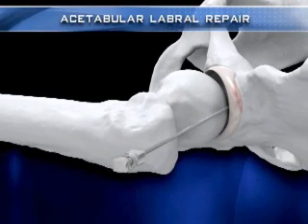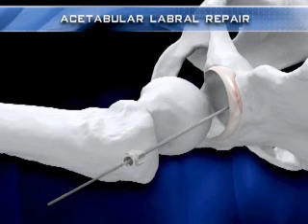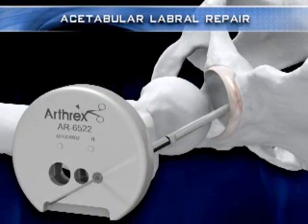After the physiological vacuum seal of this joint is broken, more distraction is achieved. A flexible nitinol guide wire is placed into the joint through the spinal needle and the needle is removed. A 5 mm dilation sleeve is advanced over the flexible wire to atraumatically dilate the hip capsule.